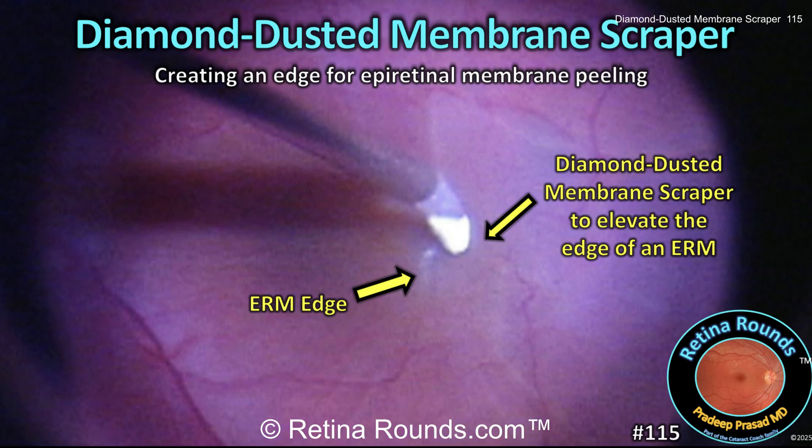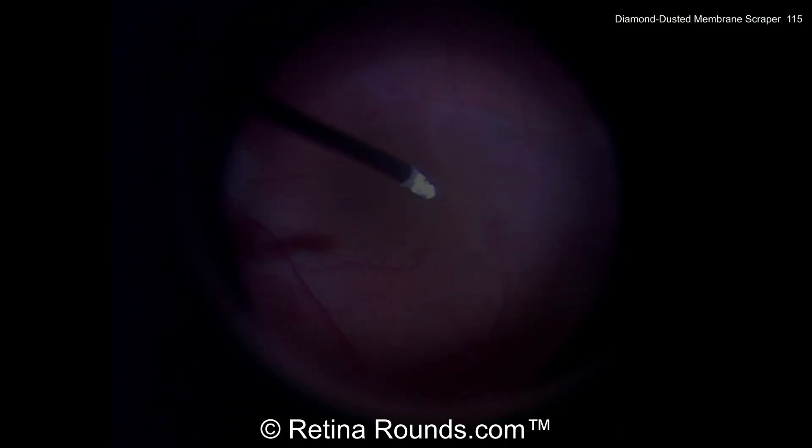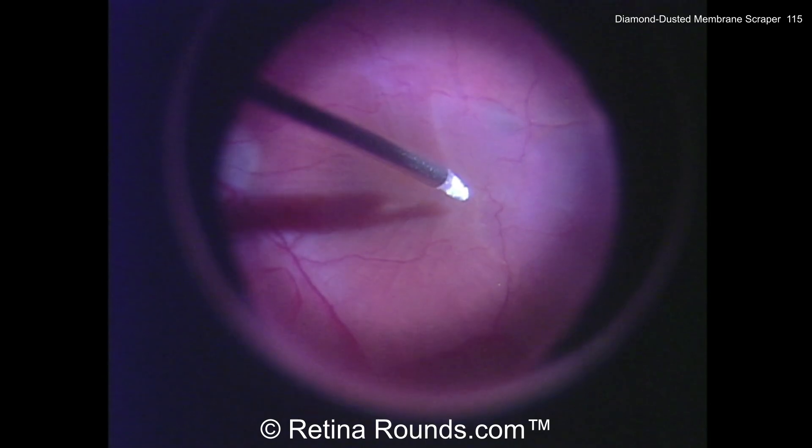At the end of the video, we'll discuss some other options to fracture and elevate an edge of ERM. Let's take a look at the surgical video.